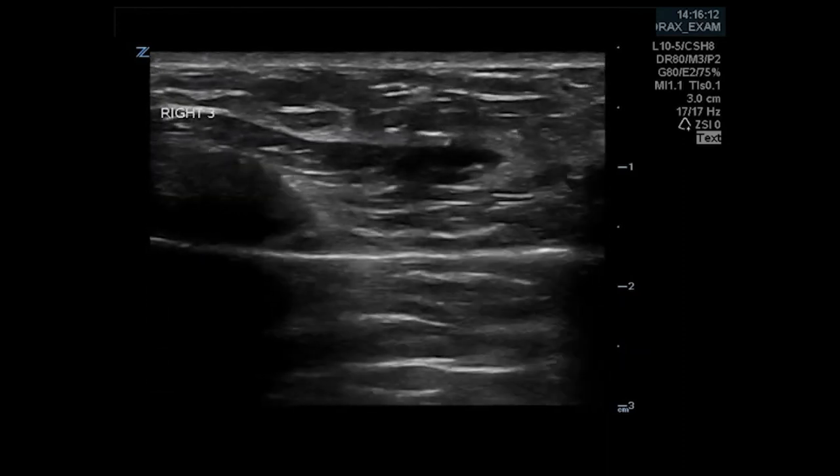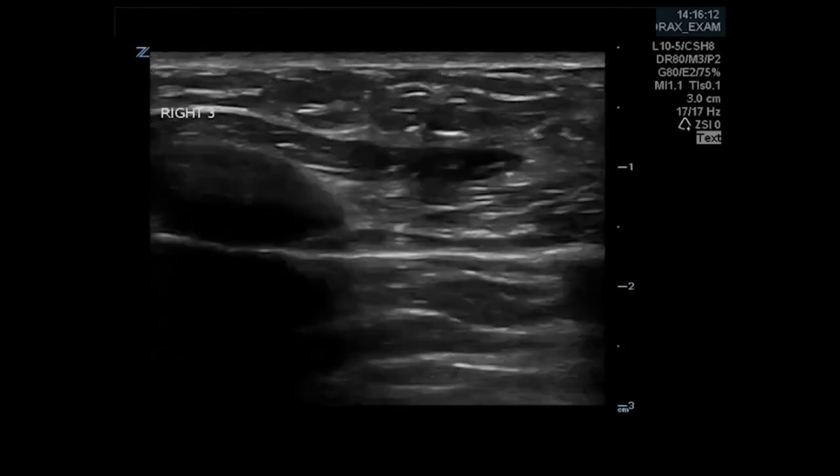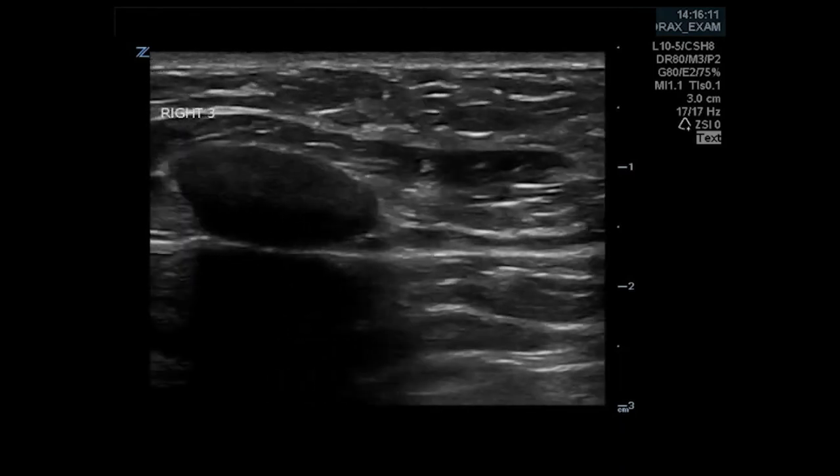The lung is no longer expanded, and the visceral and parietal pleura are no longer in contact to create the movement observed in the previous clips.